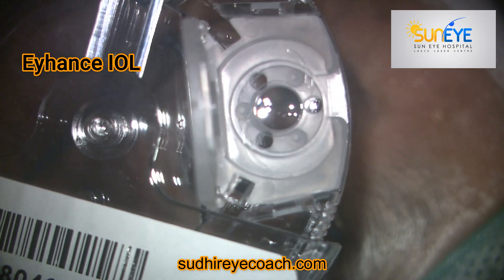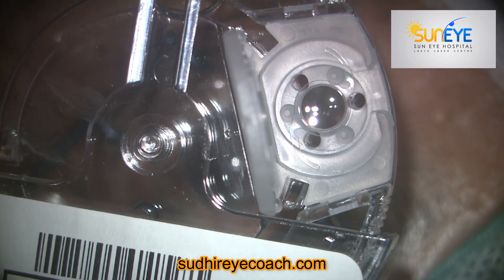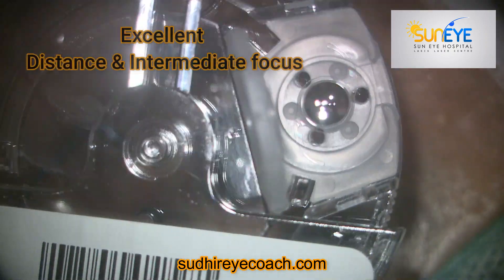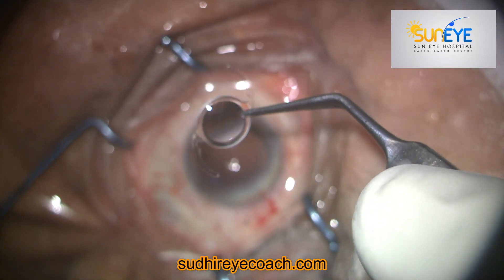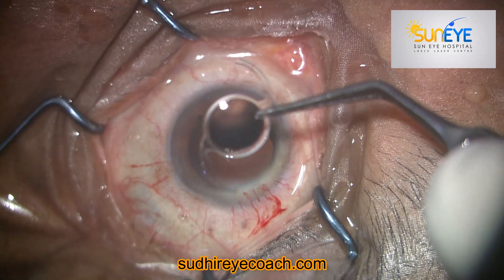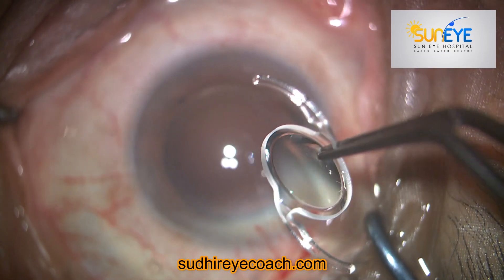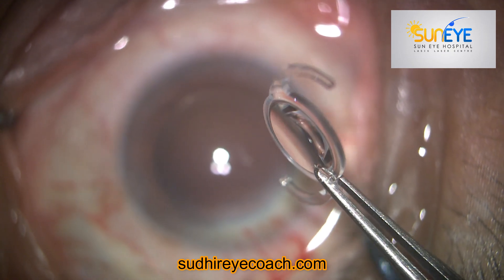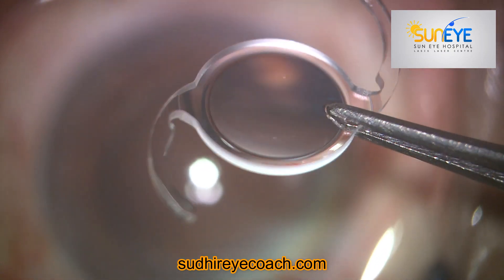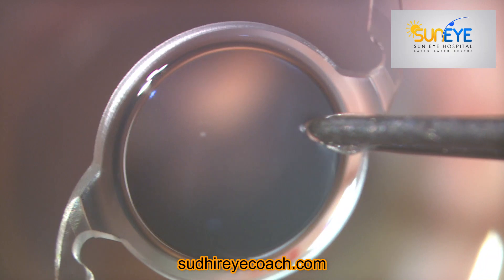This is the iHans Tecnis implant — the power is 23 diopters. The company claims it gives wonderful distance and intermediate vision. It is a kind of refractive lens and does not have any rings. As you can see, it has absolutely clear optics, and the edges are nicely squared all 360 degrees — beautifully designed edges which protect equatorial cells from migrating to the center and reduce the chances of early PCO formation.